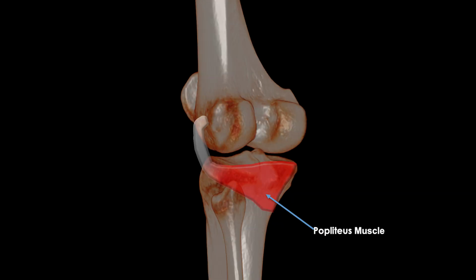The popliteal muscle, which is located on the posterior side of the knee, inserts laterally through a short tendon which starts in a small bone fossa on the lateral side of the distal femur. More posteriorly, you will find the lateral collateral ligament, which provides the knee with varus stability. This ligament starts on the lateral femoral epicondyle, then follows a posterior and oblique path until it inserts distally on the head of the fibula.